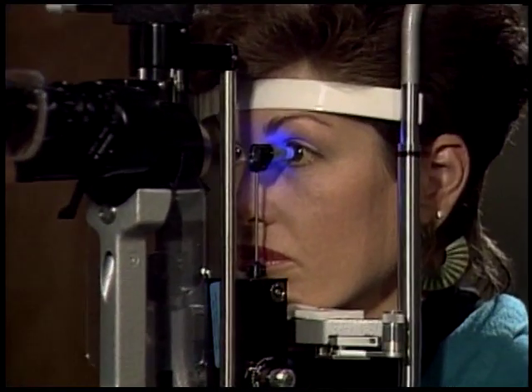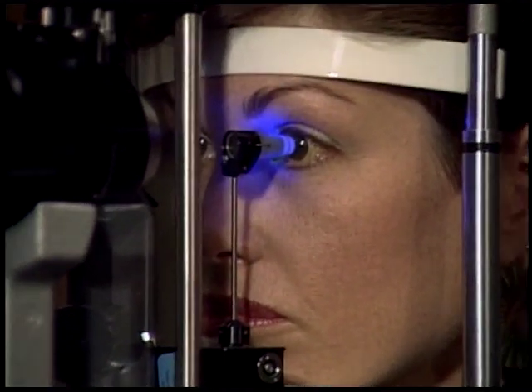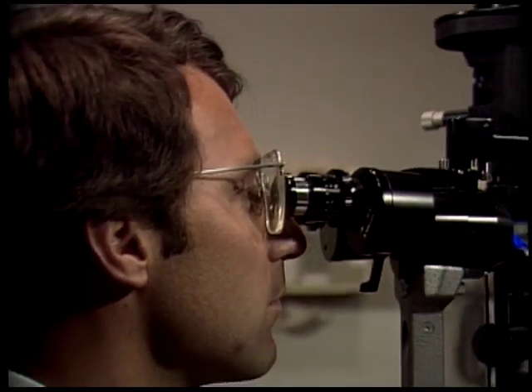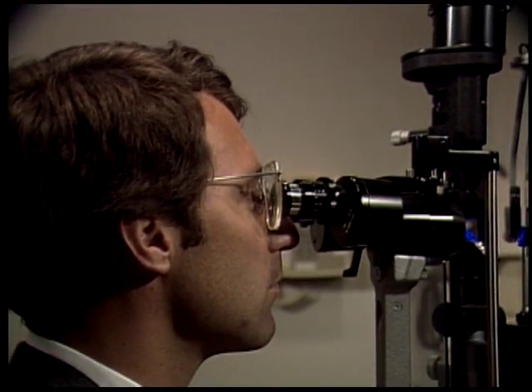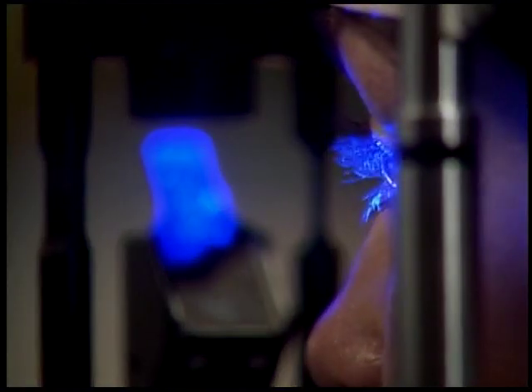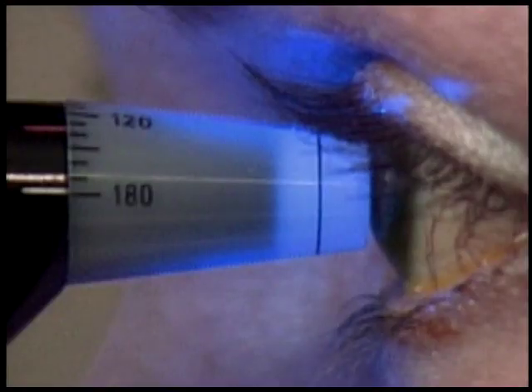In summary, Goldmann Applanation Tonometry is an important part of a complete eye examination. Developing a routine of testing is essential. Proper positioning of the patient at the slit lamp, maximum brightness of the spot, and good technique will ensure accuracy and reliability for all patients.